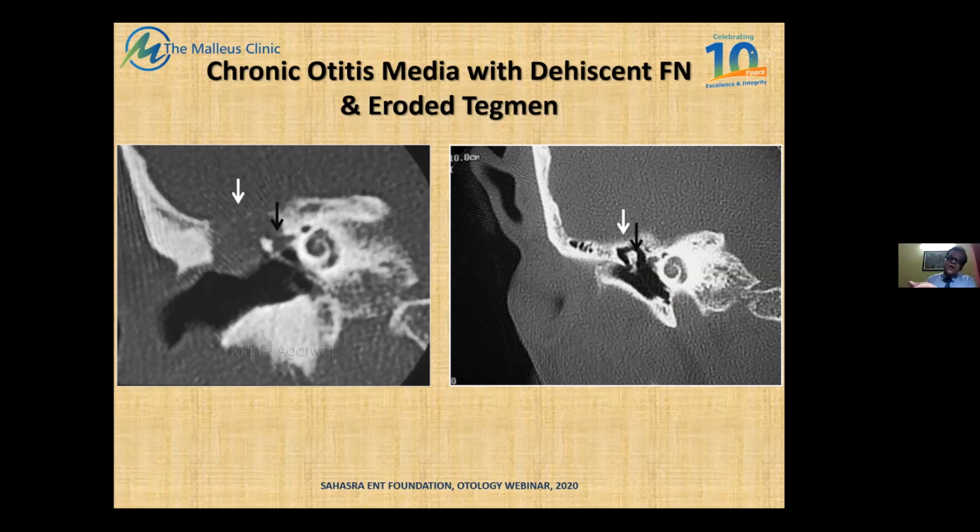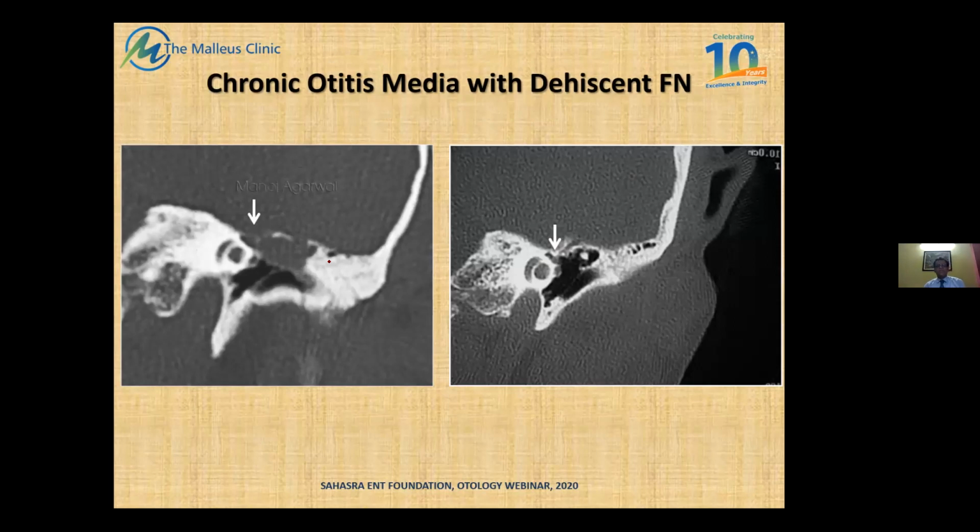The worry is not whether the facial nerve is dehiscent while doing a tympanoplasty or while doing a stapedotomy. The bigger worry is a dehiscent facial nerve while doing a mastoid surgery. Okay, look at the extent of the dehiscence over here.